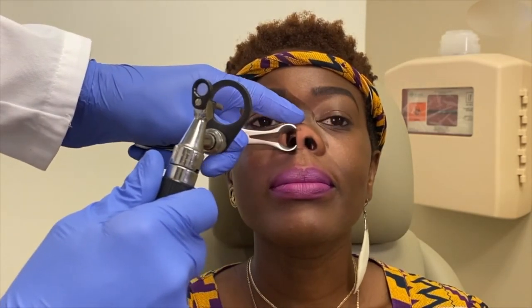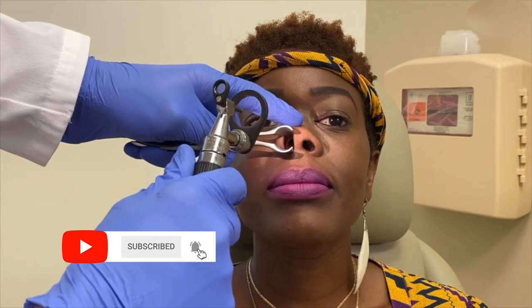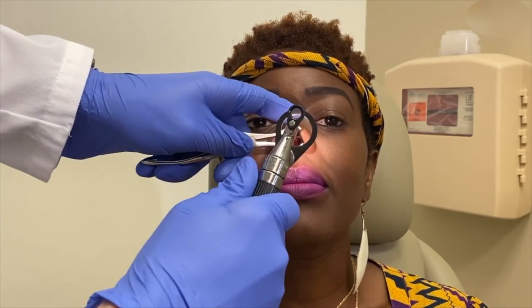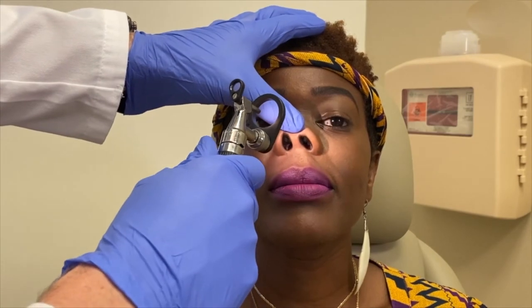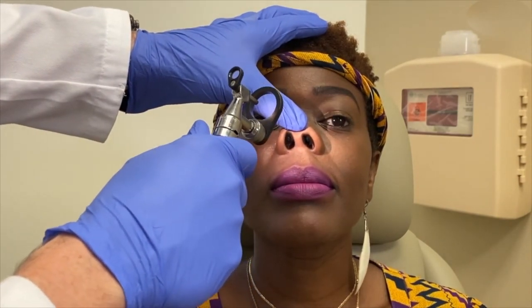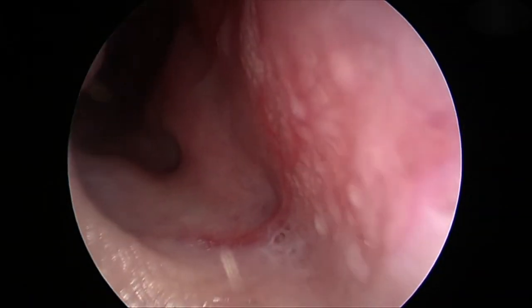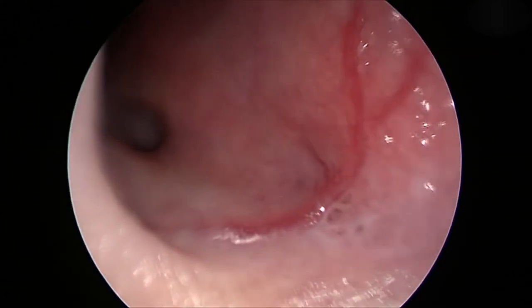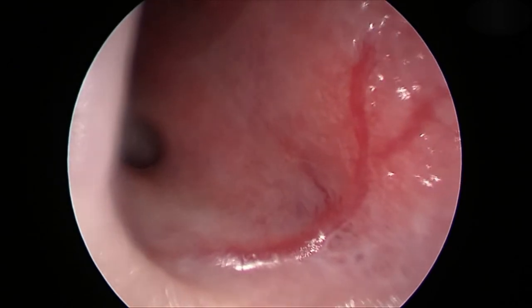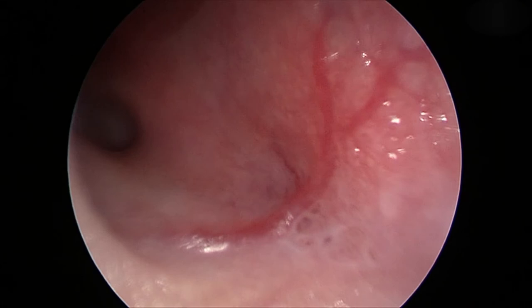To minimize patient discomfort, stabilize the nasal speculum by resting your index finger on the patient's nose. Then carefully examine the bilateral vestibule, anterior septum, inferior turbinate, and the floor of the nasal cavity. If a nasal speculum is not available, the anterior nasal cavity can be examined by gently elevating the nasal tip. Note any prominent blood vessels in the mucosal surface, and gently remove scabs or crusts with a cotton-tipped applicator. Identify the entire length of each prominent vessel, including its proximal origin, which may be along the floor of the nasal cavity.